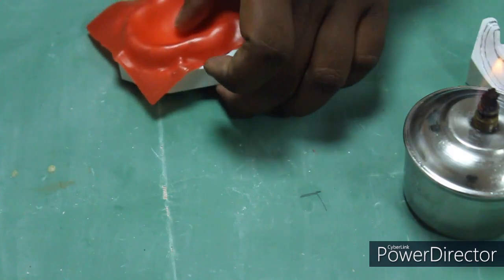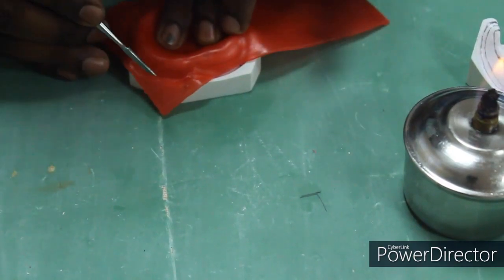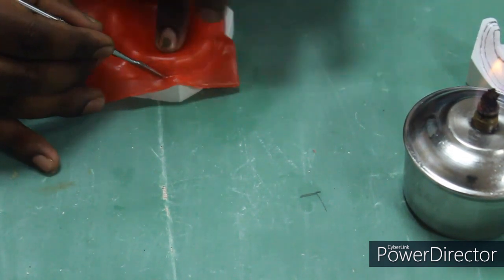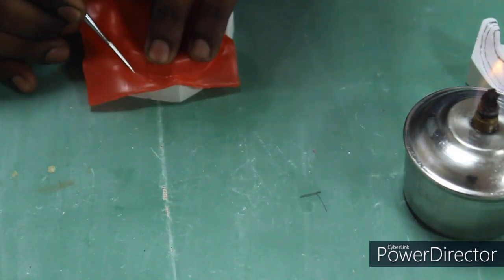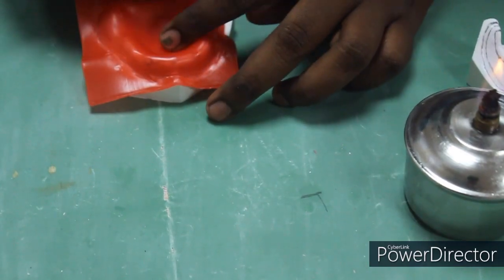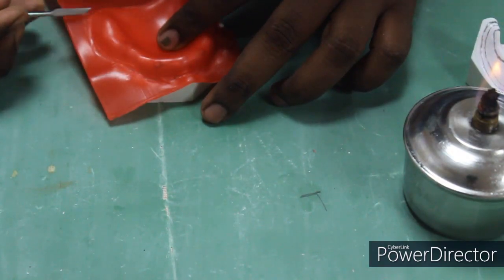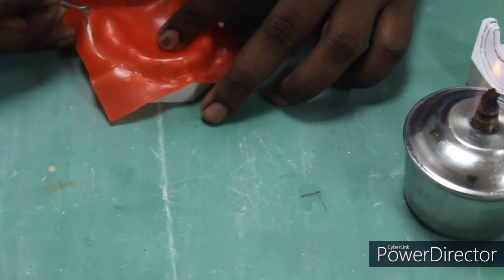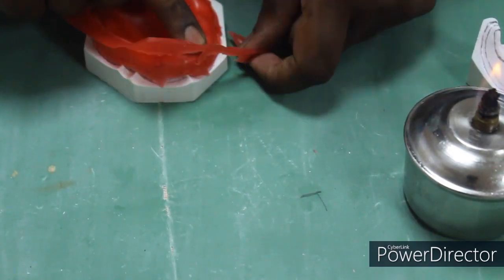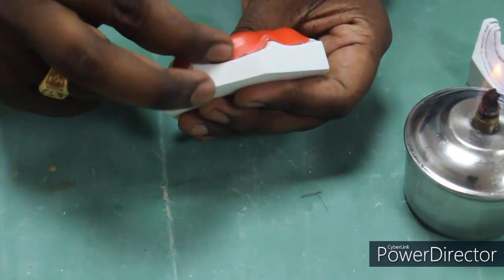So I am going to first remove the excess. After removing the gross excess, I am going to readapt this wax.